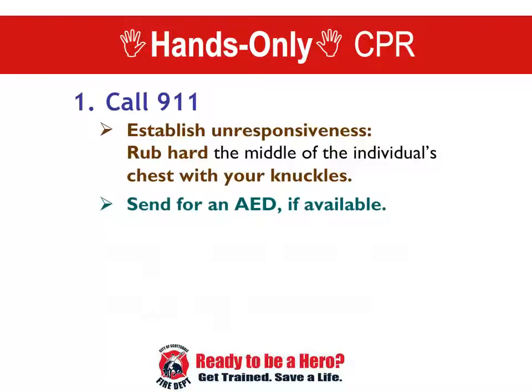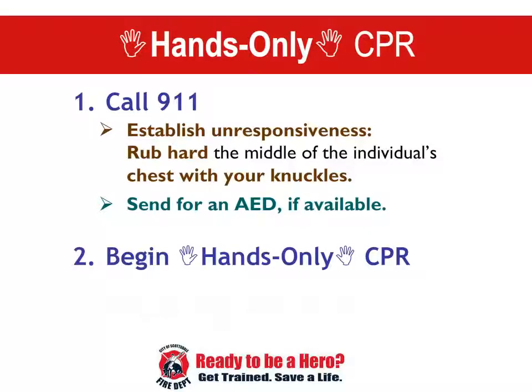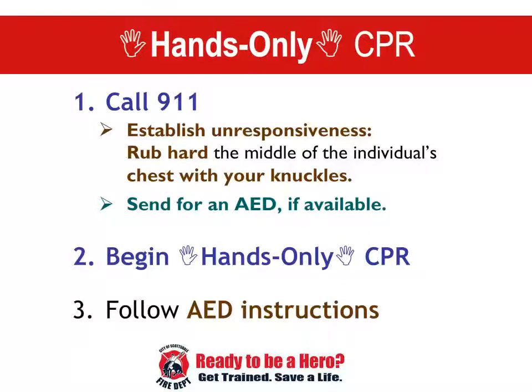If the person is not responsive, place one hand on top of the other and begin compressions. Push at a rate of 100 compressions per minute at a depth of at least 2 inches. When the AED arrives, continue compressions as the person works around you to remove the shirt and properly place the AED pads. Make sure the AED is next to the victim's head.